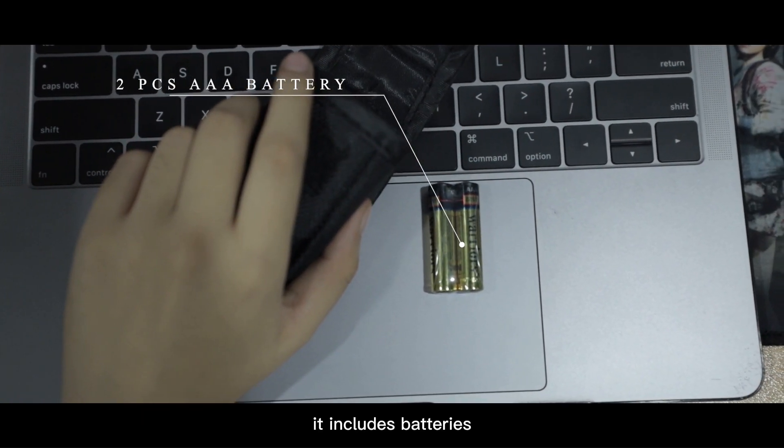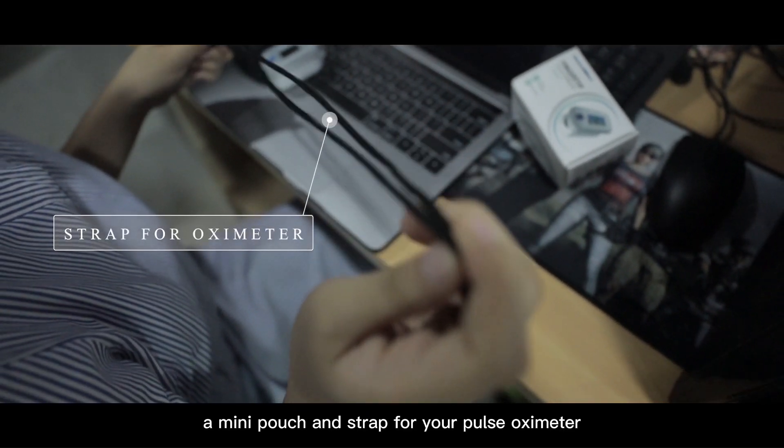It includes batteries, a mini pouch, and a strap for your Pulse Oximeter.